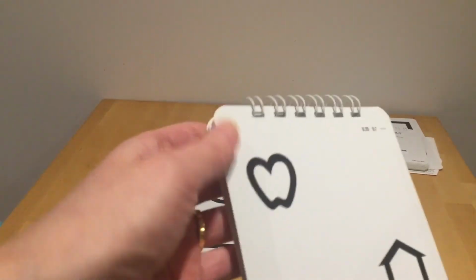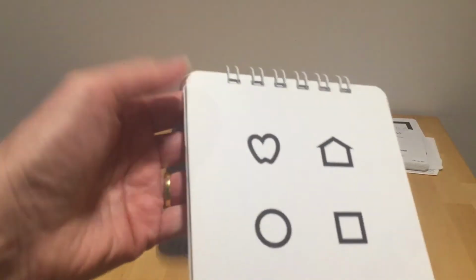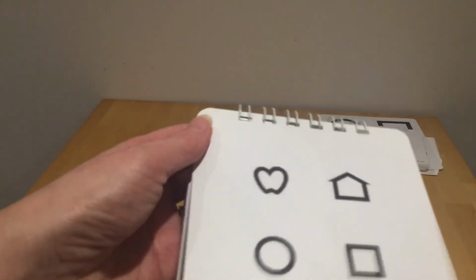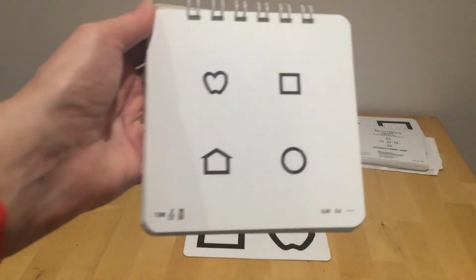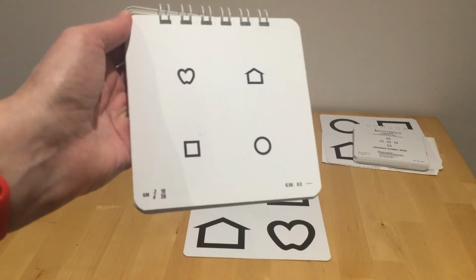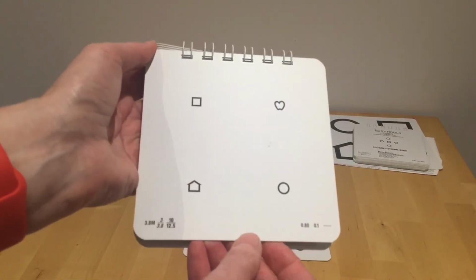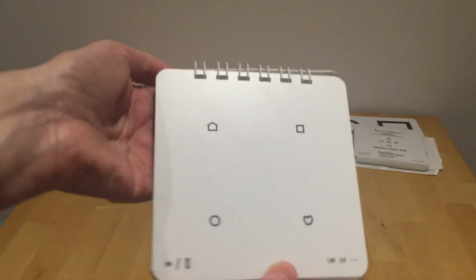And we turn it over, still 3 over 15, 3 over 12, slightly more crowded, but not completely. 3 over 9.5. 3 over 7.5, 3 over 6, and so forth, and then 3 over 3.8, wow, and then 3 over 3.